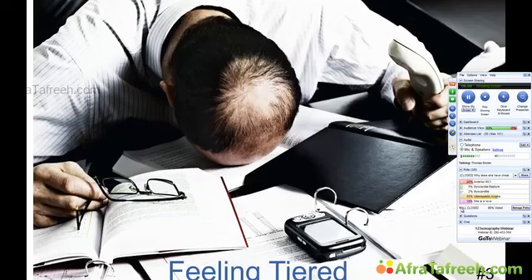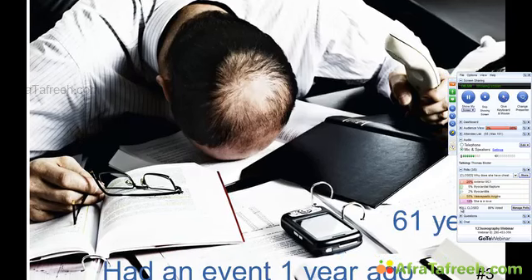It's a case of a 61-year-old patient who had an event approximately 1 year ago. And I'll tell you later what this event was because I don't want to give away the diagnosis right here. But after that, he really felt poor, and he was doing worse and worse. And somehow we were worried what was wrong with him because we could not really explain his symptoms.